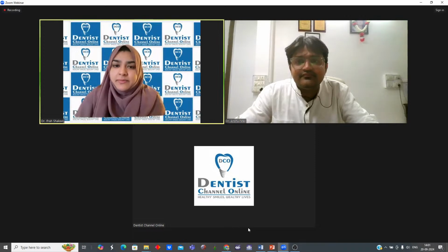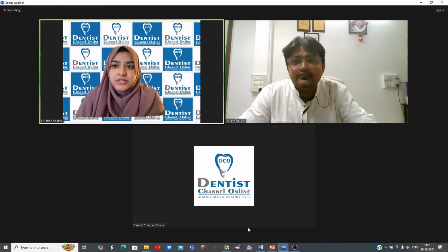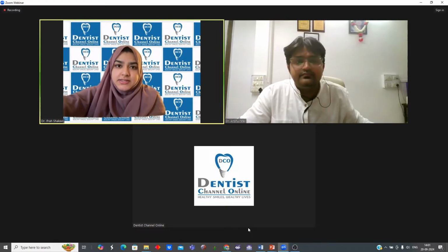This webinar will provide insights about digital implant prosthetics and its role in transforming dental restoration, the components and technologies involved in digital implant processes, including 3D imaging, CAD CAM, and how digital workflows are integrated into the planning, simulation, fabrication, and placement of digital implants.